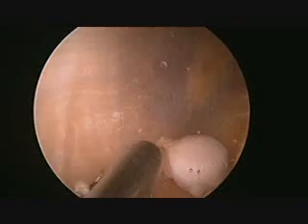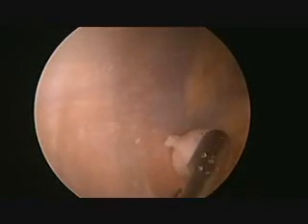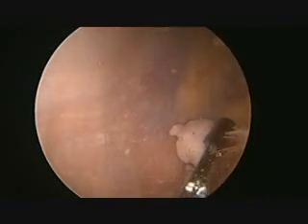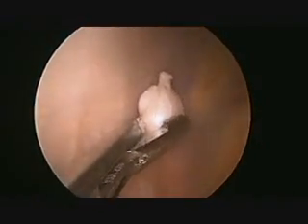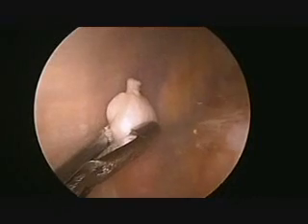A grasper is then inserted and is used to remove the loose body without any difficulty. It is important to make sure that the grasper has a secure hold on the loose body so it doesn't get lost in the soft tissue as it is being removed from the knee.